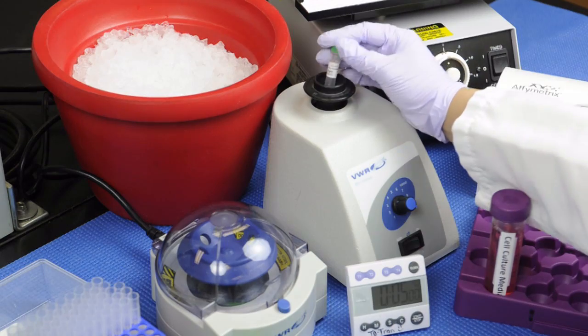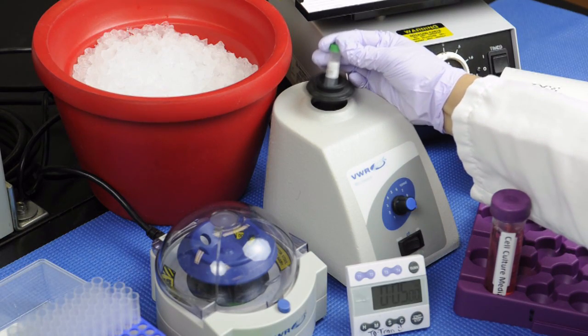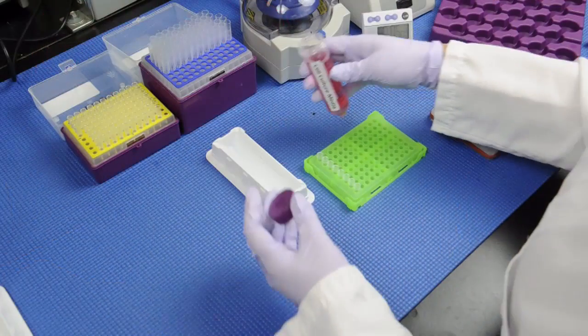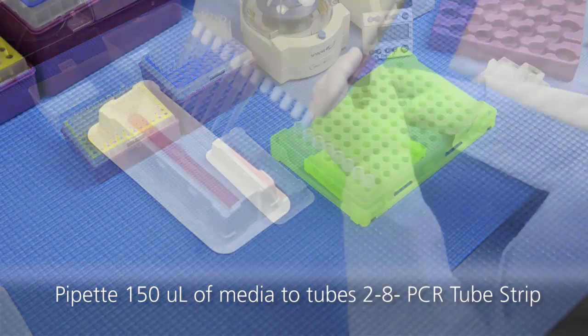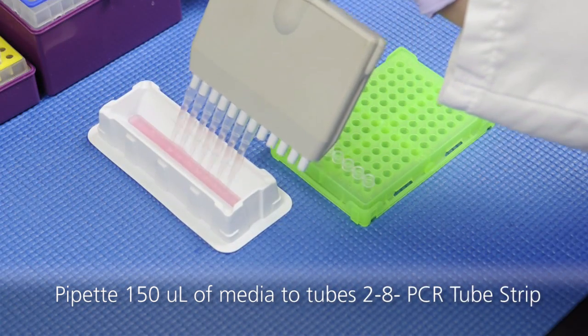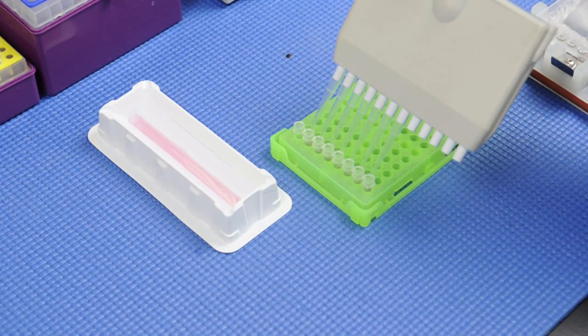After incubation, gently vortex the vial and place on ice. Using a reservoir and multi-channel pipet, add 150 microliters of media to tubes 2-8 of the PCR tube strip.